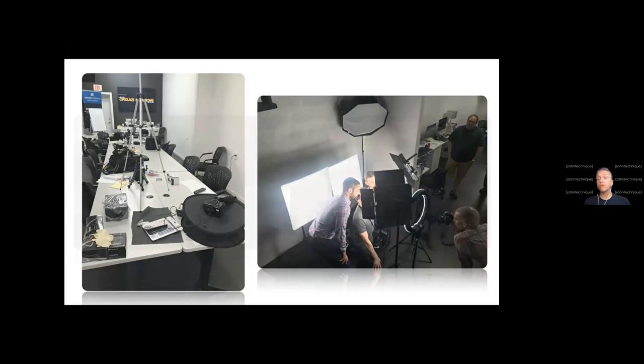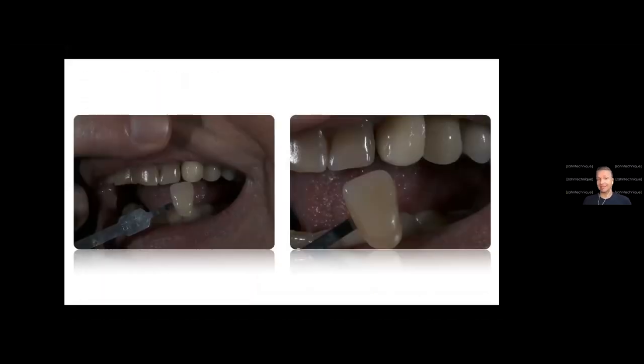Let me show you this. As you can tell, there are multiple things that are just not correct. This should be a shade communication photo. On the left side I see the shade tab — I can read it's a 4L 1.5, which is great — but I have a big finger covering the lip. The tooth isn't really visible, just half or three quarters. That's not enough. I have to see the whole tooth, so retraction in shade communication photography is extremely important.